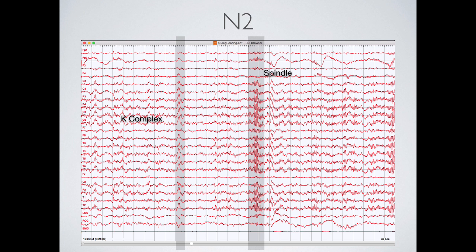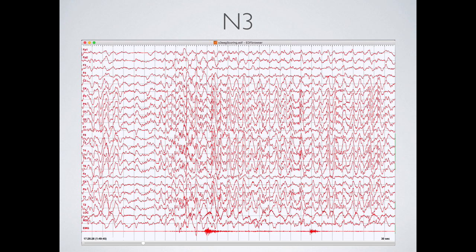And there, again, this is all from visual inspection. So an entire field of half a century of work is done looking at how these things change according to the human eye before fast Fourier transforms and spectral decomposition was available. This is that slow wave sleep we were talking about.